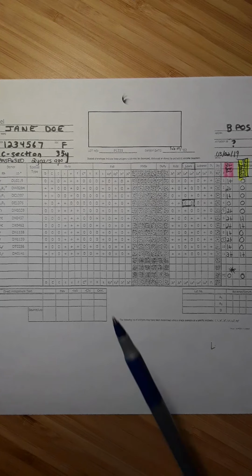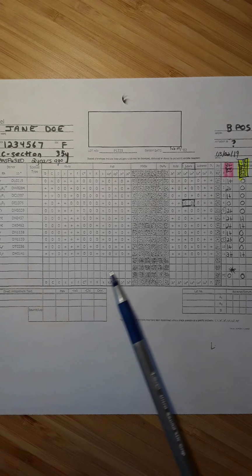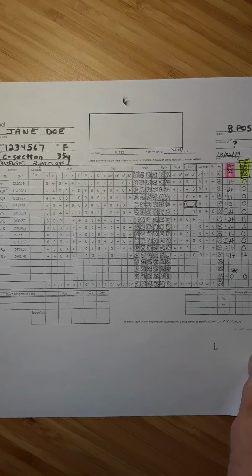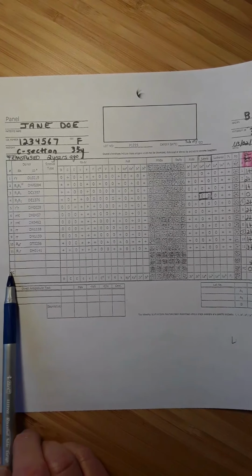So what we're going to think about here is that this patient's plasma came up positive in the antibody screen. So the next step is to do a panel. We've set up a panel. Now this panel has 11 cells. My room is waning here and my light's waning, but anyway. So this is an 11 cell panel.